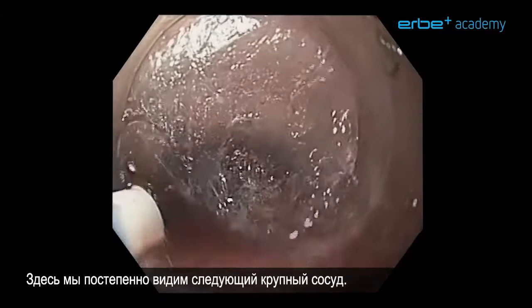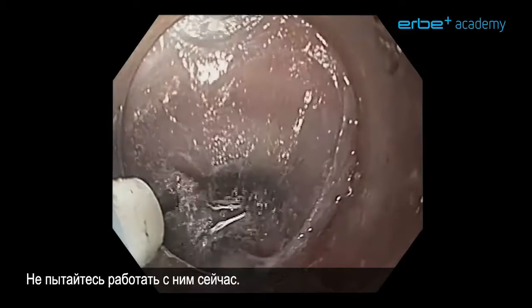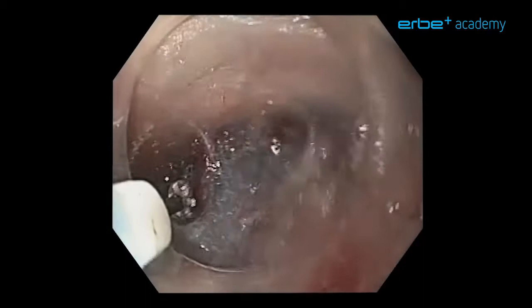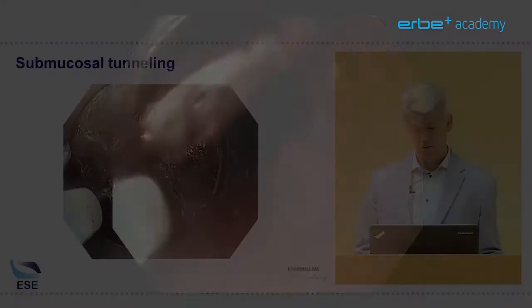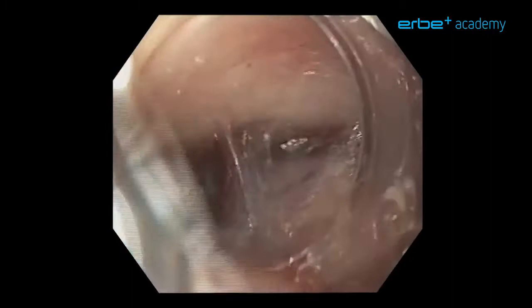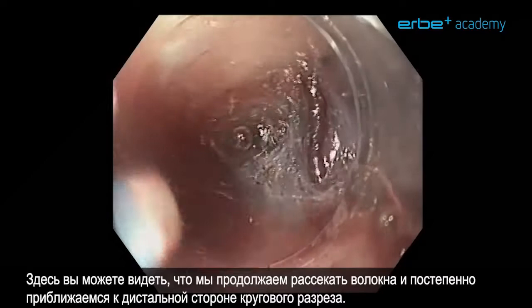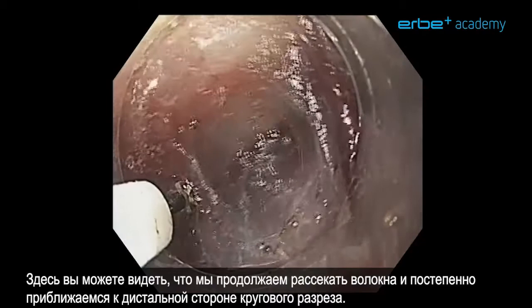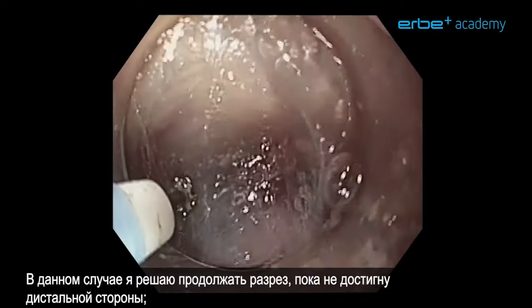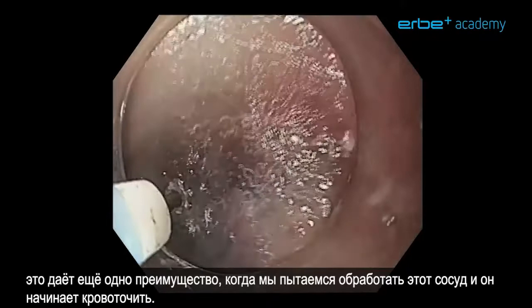Here again, slowly we see the next large vessel. Don't try to treat it now — try to dissect around it so you have the best possible situation to handle the vessel. We are still in the same tunnel, trying to clear the vessel a little bit more, and we continue cutting fibers. We are already approaching the distal side of the circumferential cut. I decide to go on cutting and continue until I have reached the distal side.